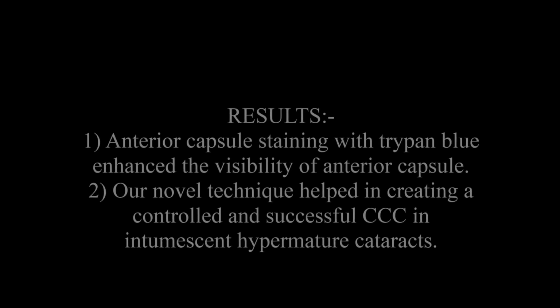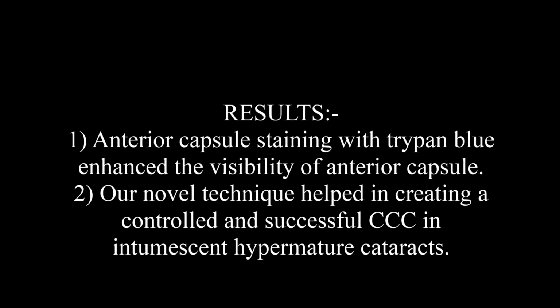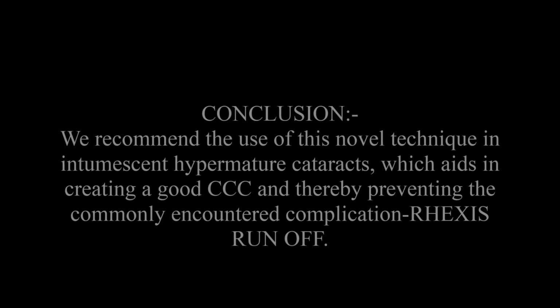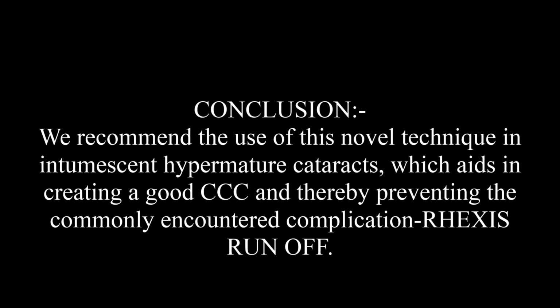Results: anterior capsule staining with the blue dye enhances the visibility of the anterior capsule. A novel technique helped in creating a controlled and successful CCC in intumescent hypermature cataracts. To conclude, we recommend the use of this novel technique in intumescent hypermature cataracts.